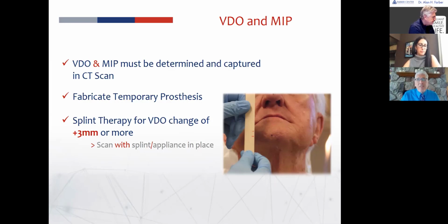And many of those have been double arch cases. And prior to that, I've done probably about 60 conventional arches at the laboratory where I would go chairside and do the conversions. And there's no comparison. When you follow these steps, it may be a little bit more up front, and really it isn't, but it may seem like it if you're not doing it the conventional way and you're making it up the day of surgery. We want surgery to be very smooth and minimize the time there for that patient that day.